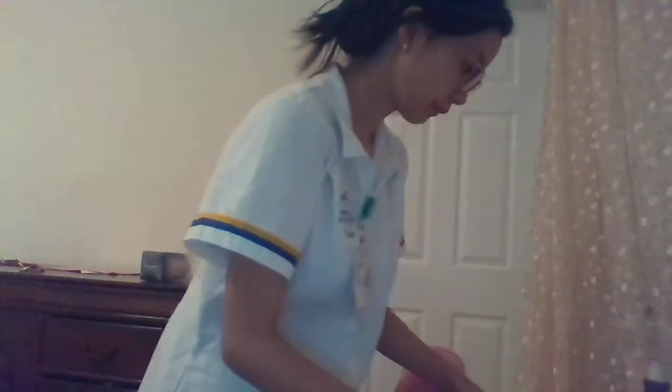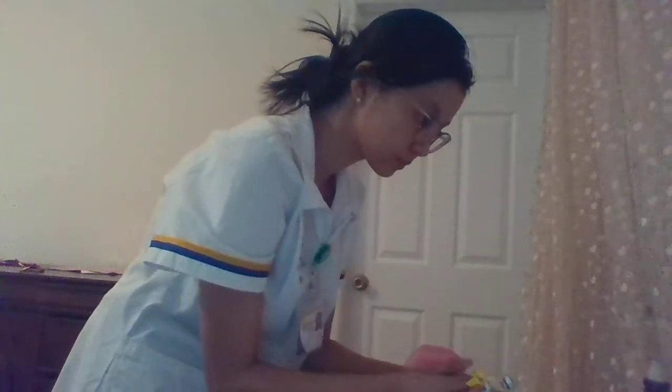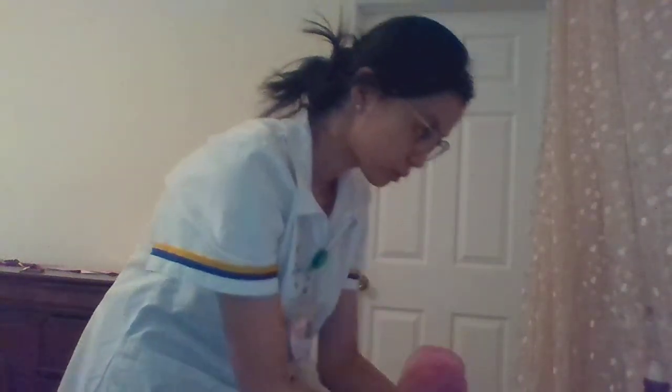Okay. After I'm done, I am going to label this one, with the time and the date, today's date, and my initials on the label.